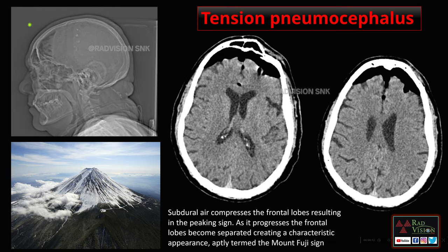This tension pneumocephalus typically mimics the Mount Fuji sign — this is the Mount Fuji sign. I have shown this case because it is very rare for us to see pneumocephalus or tension pneumocephalus on a plain radiograph or topogram of the skull. This was tension pneumocephalus diagnosed on the topogram, and these are the corresponding axial images showing the typical tension pneumocephalus which classically mimics the Mount Fuji sign.